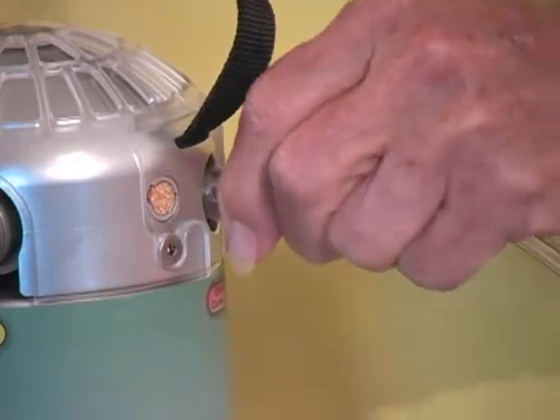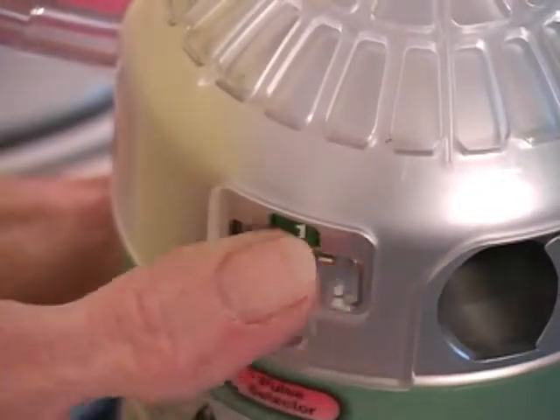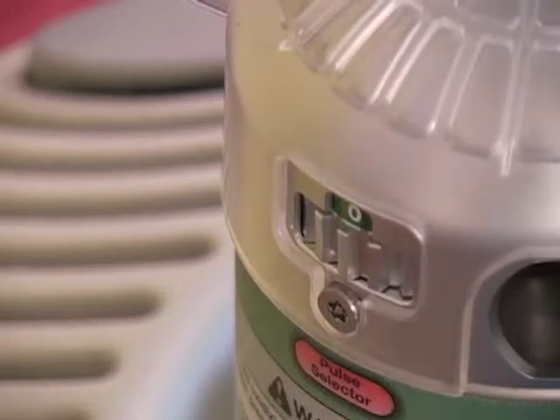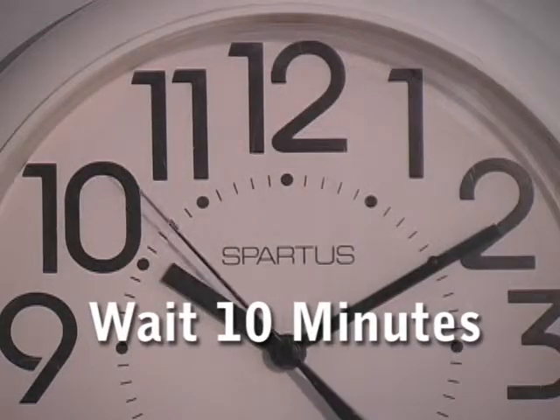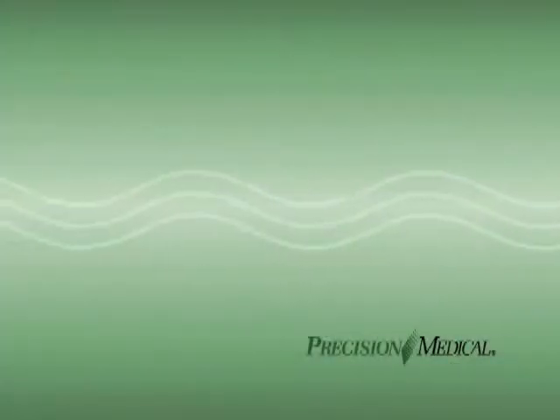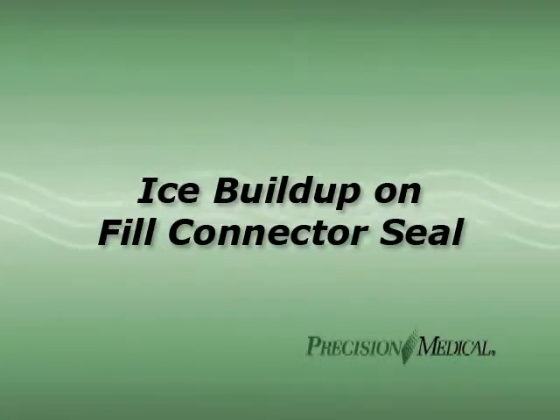Attach the cannula and set the pulse selector to your proper liter flow. If the unit doesn't pulse yet, set the pulse selector again to zero and wait 10 more minutes. If liquid oxygen leaks out at the fill connector when you disconnect the portable, reconnect and disconnect the portable unit to dislodge any ice or other obstruction. Contact your oxygen supplier if the liquid leak persists.